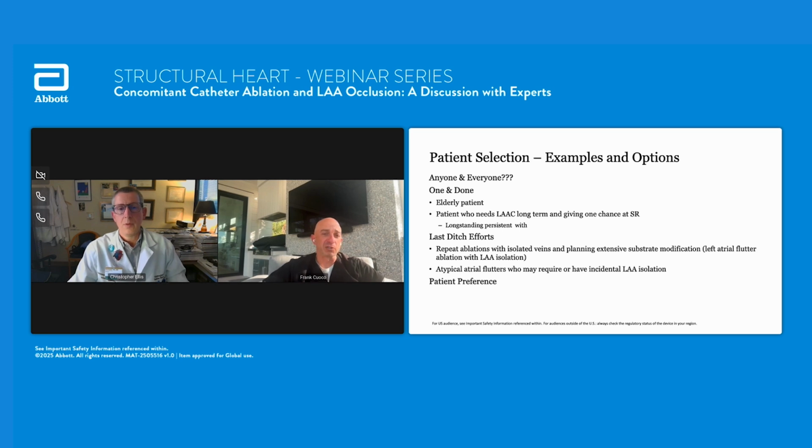I think what is interesting though is, and maybe I'll bring this up later, the question is, when you do that ablation, especially with a device like Amulet, what additional substrate modification are you going to do? How does the device interact with pulsed field ablation technology going forward? Will it limit where you can ablate or what substrate you might want to ablate? As you know, certain devices, if they're not fully endothelialized, can prevent delivery of pulsed field ablation energy in certain locations in close proximity to the device.